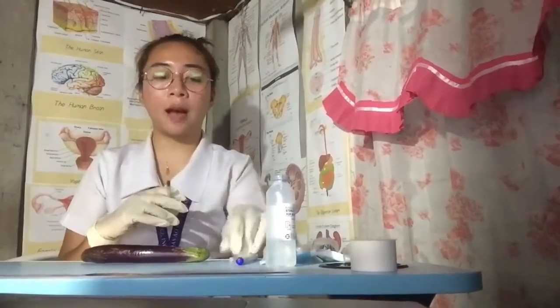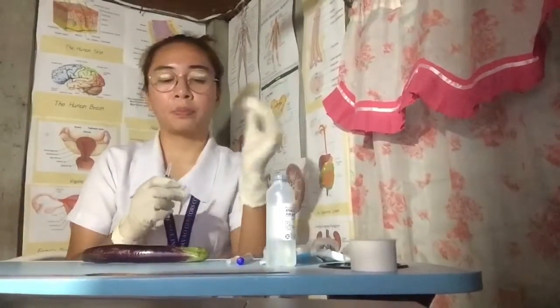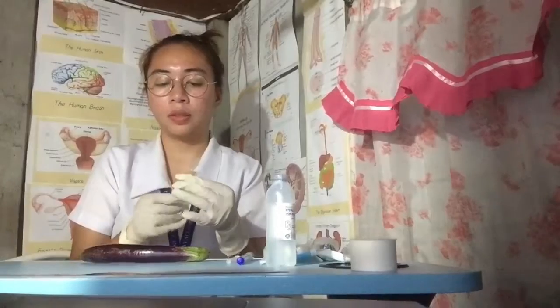And now remove the needle cap. But for now, I'm going to use another needle to show the size. Now inject the medication. Grasp the syringe with the dominant hand between the thumb and fingers, with the thumb side upward for a 45 degree angle insertion, and palm downward for a 90 degree angle insertion. Prepare to inject using the non-dominant hand to pinch and spread the skin, and the needle using the dominant hand, firm and steady to push.